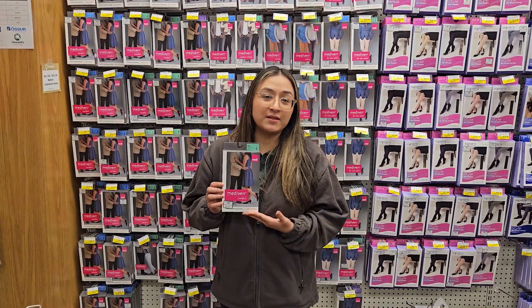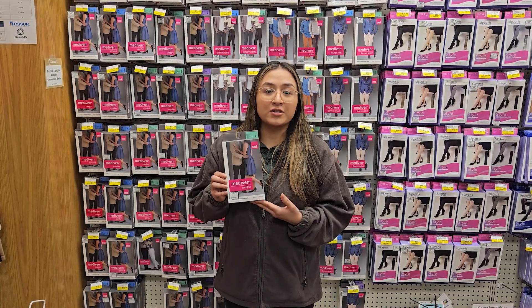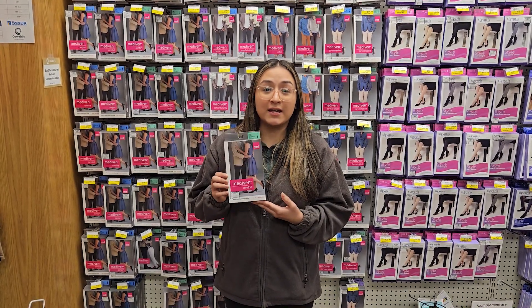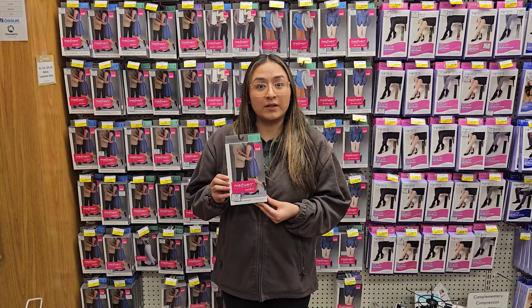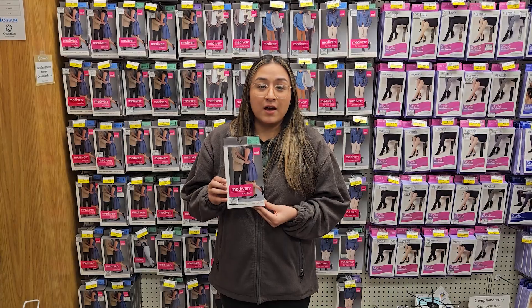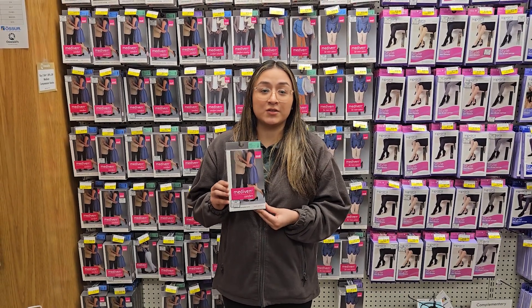The next level we're going to have is the 20 to 30. These have a higher compression level, so they're definitely going to be a lot tighter. These are definitely used for severe swelling — you can really tell the difference in your ankles. These are also used post-treatment and pre-treatment for any vein surgeries.